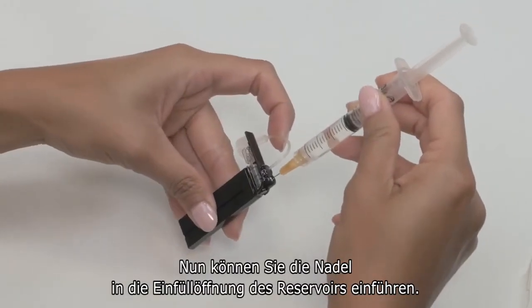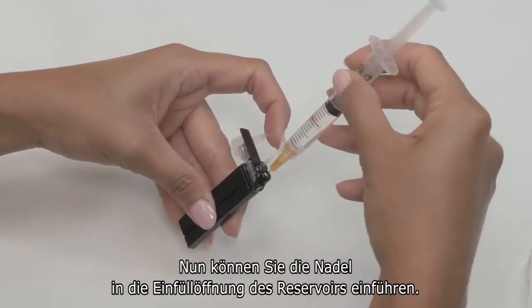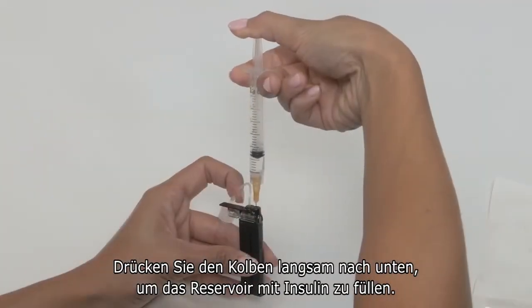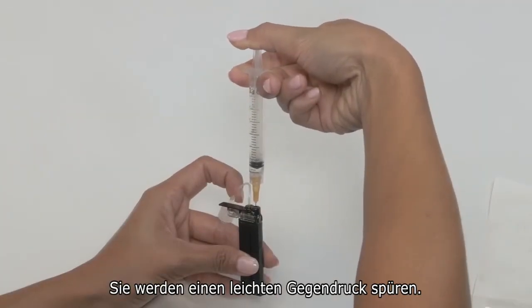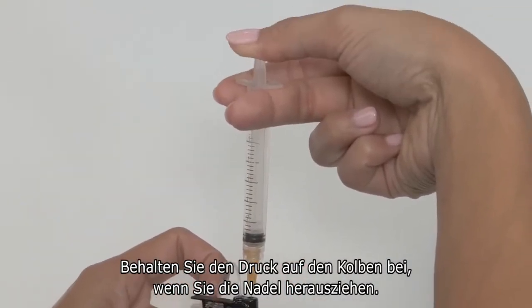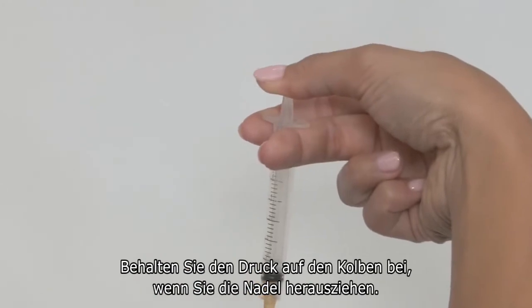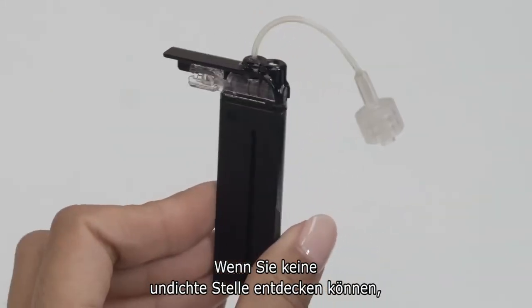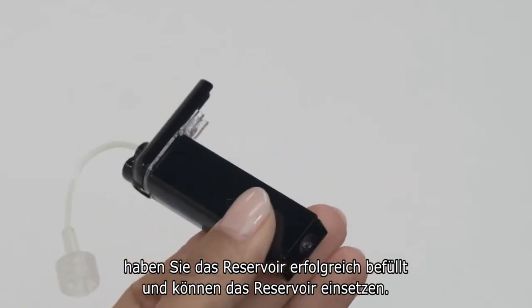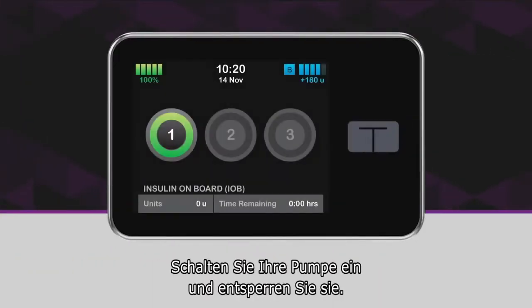Now it's time to insert the needle into the fill port on your cartridge and slowly press the plunger to fill your cartridge with insulin. It's normal to feel some resistance towards the end. After you've filled your cartridge, maintain pressure on the plunger as you remove the needle. If everything looks good and there are no leaks, you've successfully filled your cartridge and are ready to install it onto your pump.